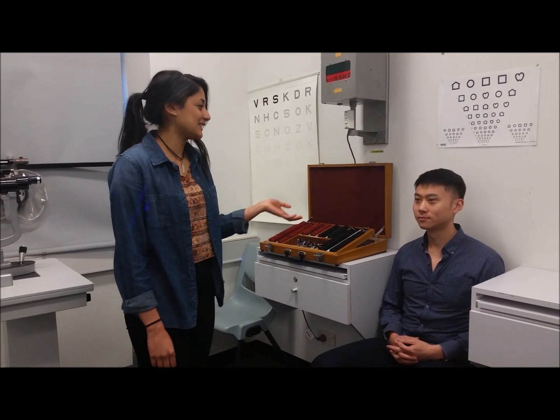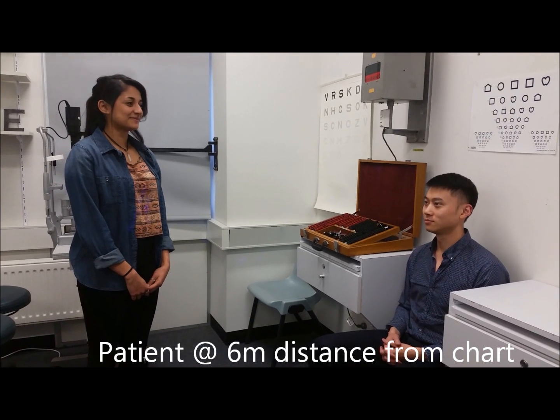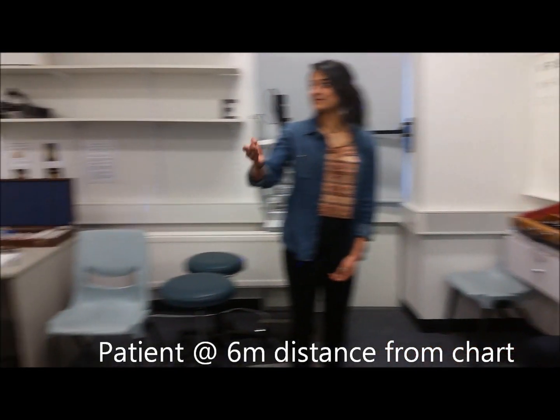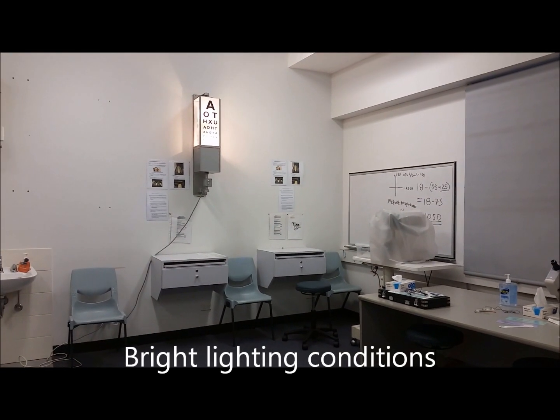I'm Tash, I'll be the orthoptist for today, and this is Hongbin, our patient, and we've just induced astigmatism for the purpose of this video. Before beginning the assessment, the patient should be seated at a 6 metre distance from the Snellen chart. The test must be performed under bright lighting conditions.